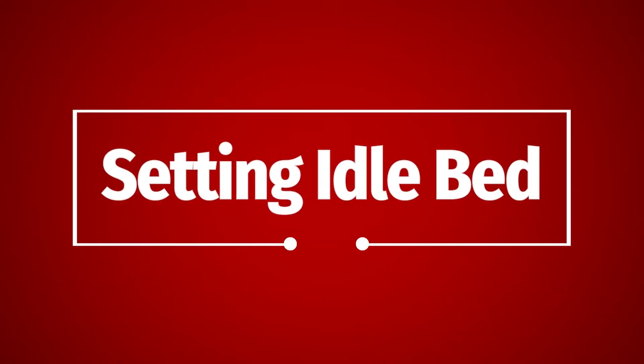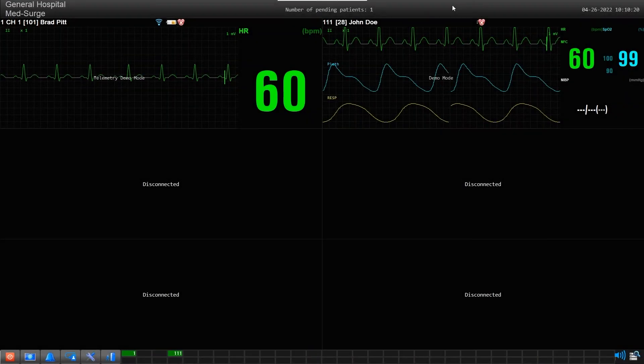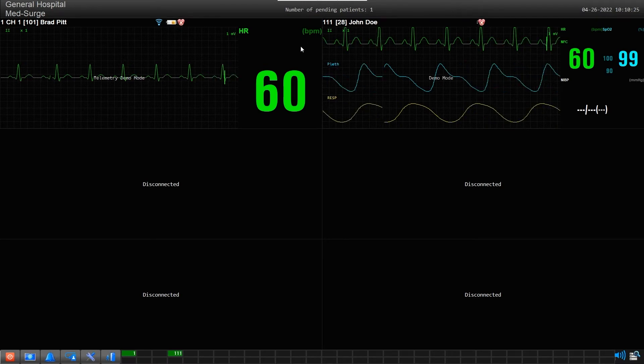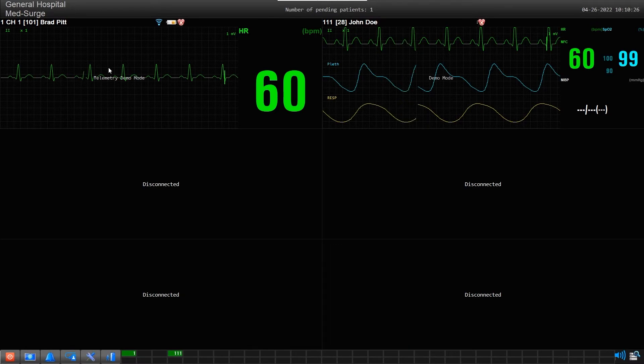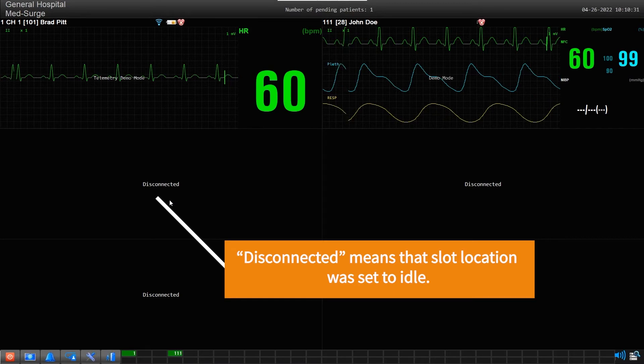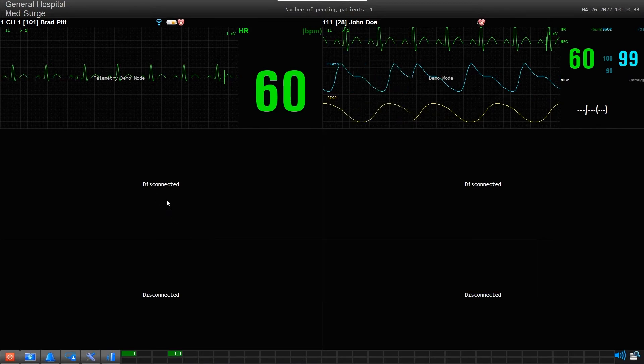Setting Idle Bed: Patient Slots can exist in one of two conditions. It can either be assigned a patient device or be set to Idle Bed. An Idle Bed can be recognized by the word 'disconnected' written in that slot location.